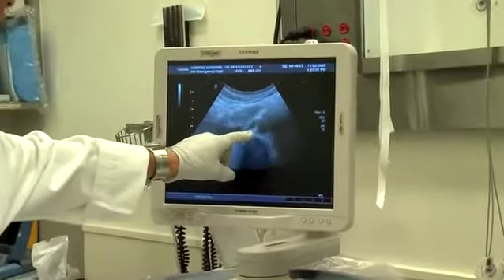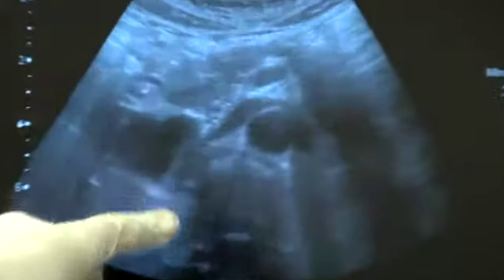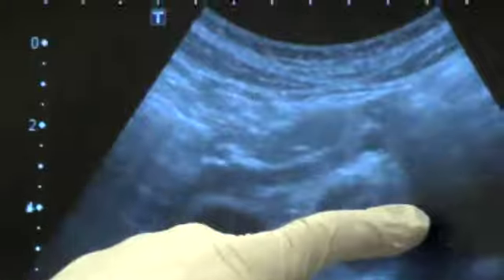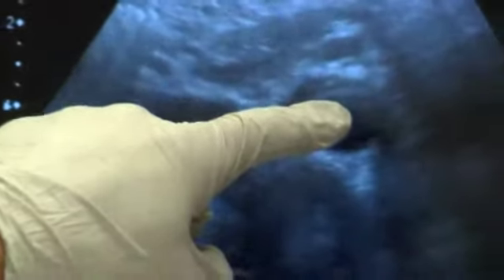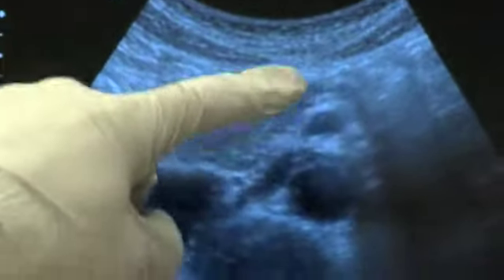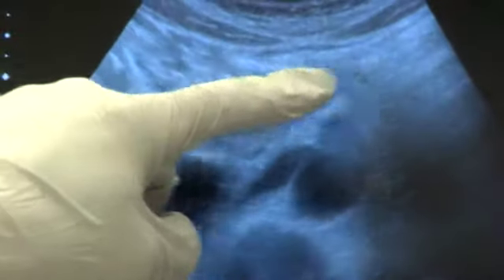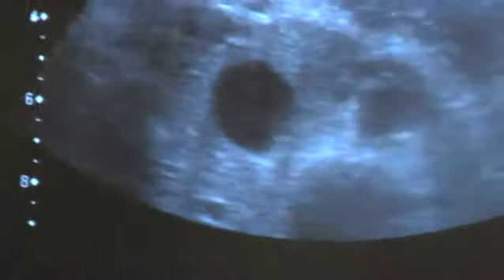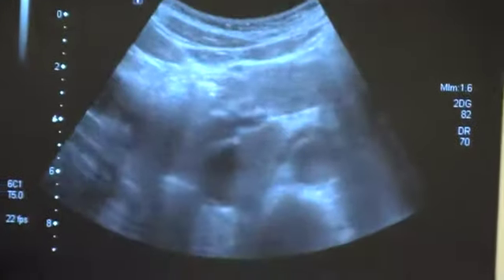So we see the spine shadow, and we see the aorta and the IVC. Coming off of the IVC is the left renal vein. Above the aorta and above the left renal vein, sort of nut cracking between the left renal vein and this large structure up here, which is the splenic vein, is the SMA. So the SMA, of course, is the second takeoff of the aorta, which means we need to come a little bit more proximally if we can. And we're going to look for the first takeoff of the aorta, which is the celiac axis.